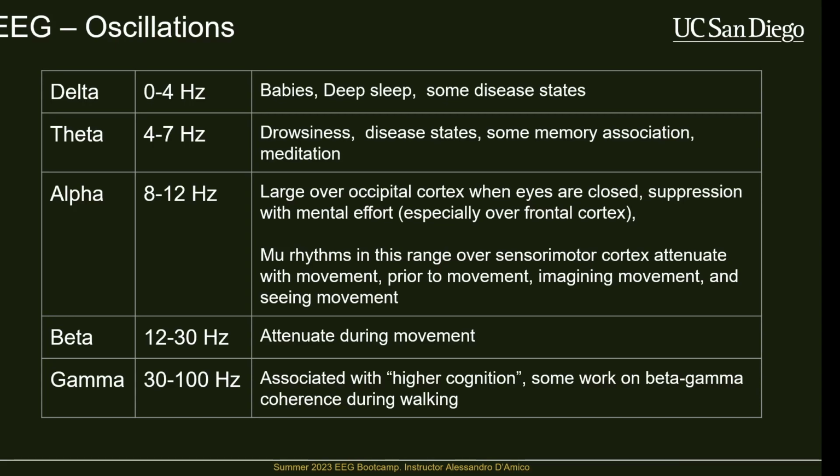And that's typically only ever seen when you're not doing any motor actions or planning on doing any motor actions, over the sensory motor and motor cortex. When you actually start doing a movement or plan on doing a movement, those oscillations dampen. So they don't get bigger when you're doing a movement, they get smaller.